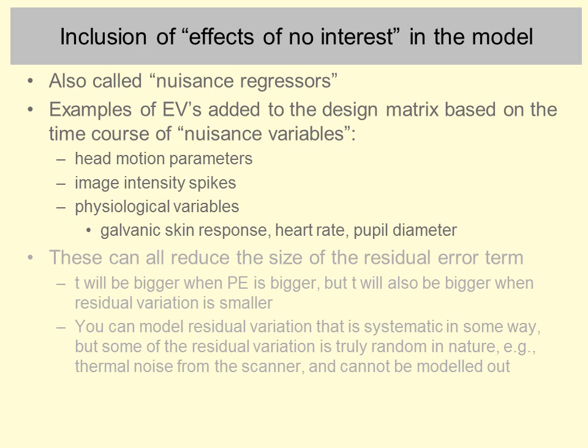Now isn't that a bit odd that you first do a pre-processing step to try and adjust the actual images to remove problems due to head motion, and then you go and include estimates of the head motions in the model as well? You'd think the problem should already be gone before the modelling stage, but I suppose people are reasoning that there is still some variation in image intensity in the data due to head motion because of the imperfections of the motion correction process. I mean, you can read literature about whether or not to include these head motion parameters. I think people disagree on whether it's useful or not.